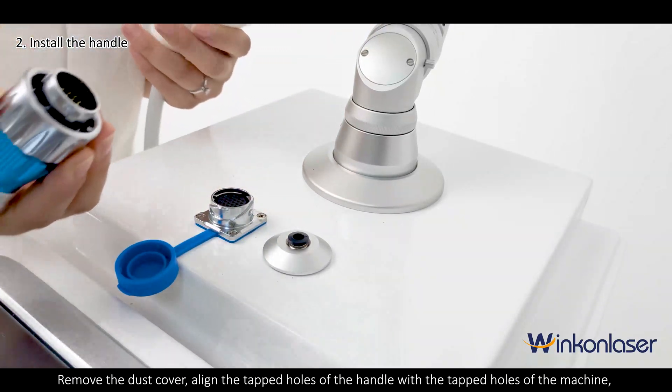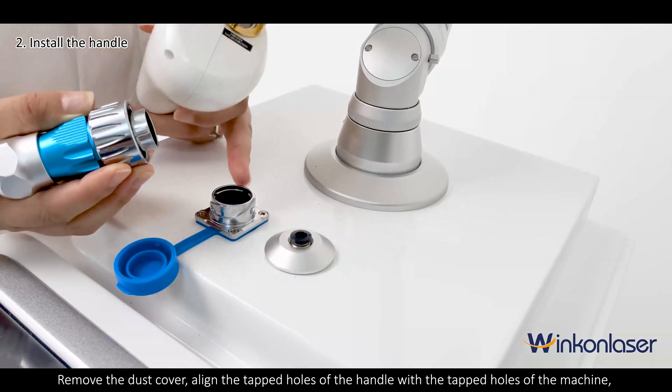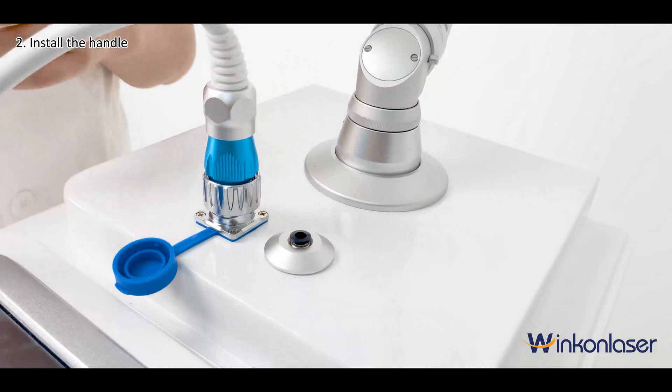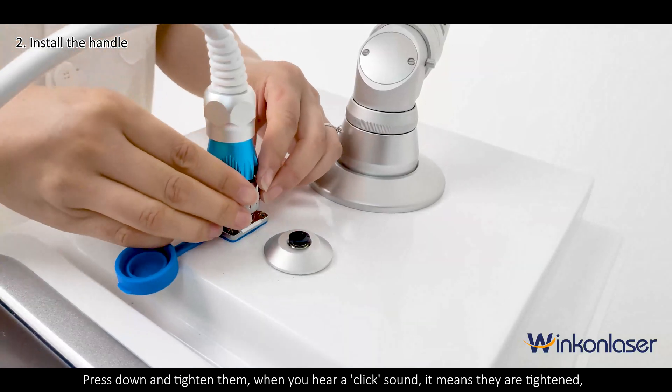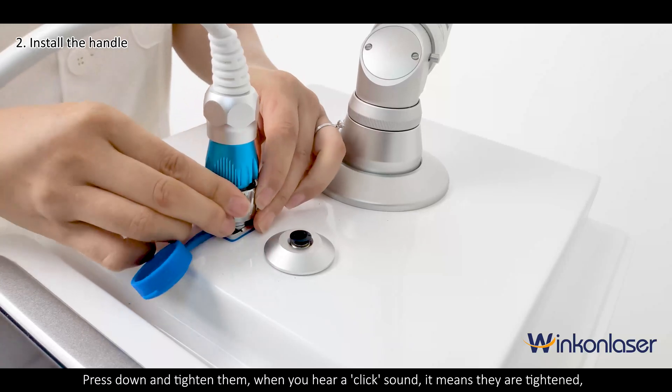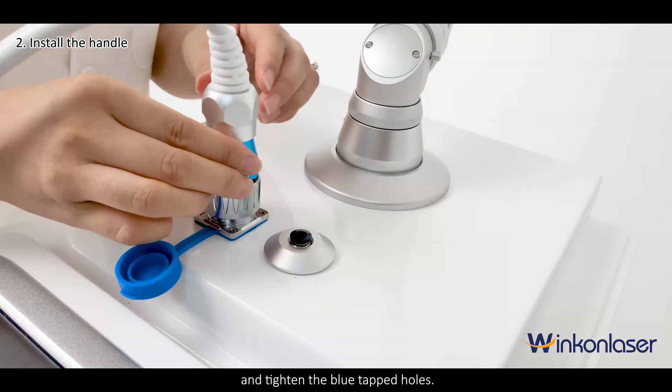Remove the dust cover and align the tapped holes of the handle with the tapped holes of the machine. Press down and tighten them. When you hear a click sound, it means they are tightened. Then tighten the blue tapped holes.